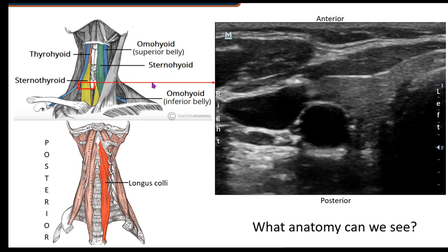Down here, look at that relationship of the omohyoid right underneath the sternocleidomastoid — it should be a thin strap-like muscle, which indeed it is. Here is the omohyoid, and then the sternothyroid, and then the sternohyoid overlying. In general, just knowing this line of tissue and structures is going to be your strap muscles. We hit our neurovascular bundle, and deep to that IJV, here's one of those nice little lymph nodes — one of those little jelly beans. We want our thyroid gland to have that uniform echo texture, with its echogenicity at a higher grade than that of the muscles.